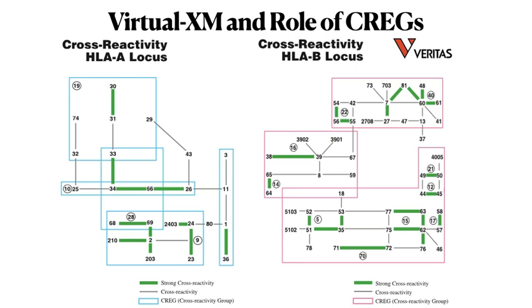Whenever you have antibody against 81 and 48, and the donor antigen is 60, the antibodies against the donor HLA 60 will also react to 81 and 48. So these are cross reactive HLA molecules.